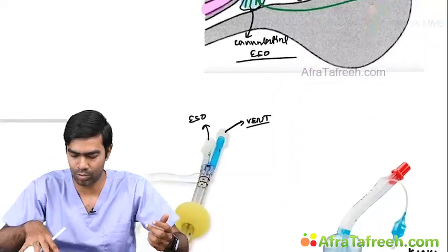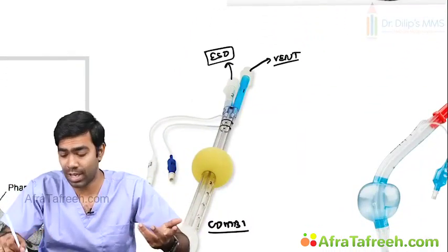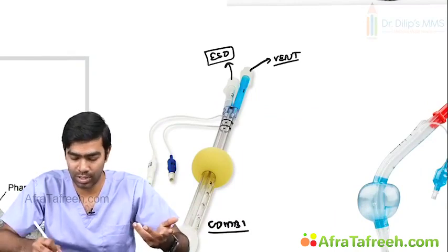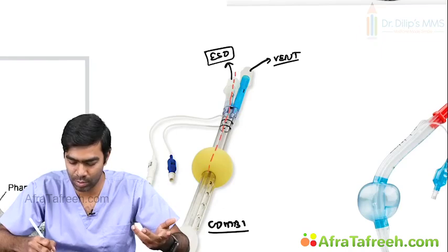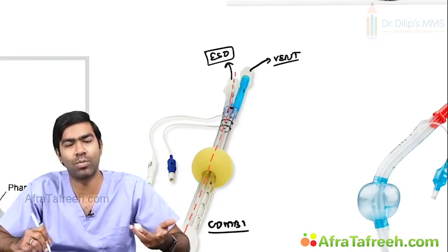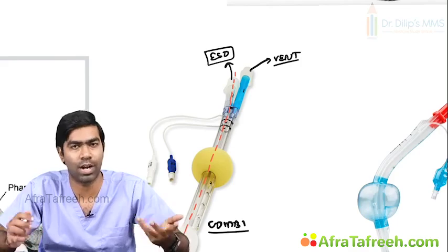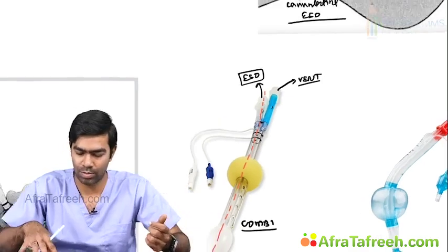A lot of these laryngeal tubes have a provision so that you can drain the aspirations. If any content is there in the stomach, you can drain through this esophageal port also. For example, you have an esophageal port here, and a lot of laryngeal tubes have advancements in such a way that you can even insert a nasogastric tube through these ports. Once you insert a nasogastric tube, you can aspirate the contents out. So a lot of advances are there in these laryngeal tubes. Fine.